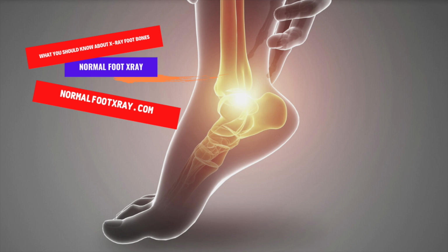A doctor who uses an X-ray to diagnose a foot problem will make sure that all the bones are visible. The most common problems that require an X-ray of the foot are broken bones and joint dislocations. A doctor will use this imaging method to confirm a diagnosis of general foot pain, swelling, and tenderness. Using an X-ray of the foot will help a doctor determine the cause of common foot ailments.